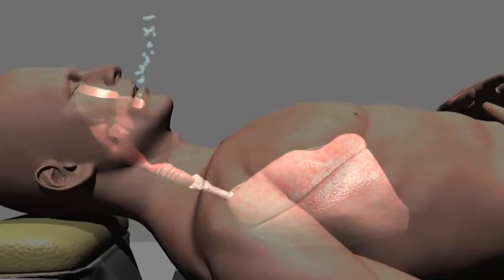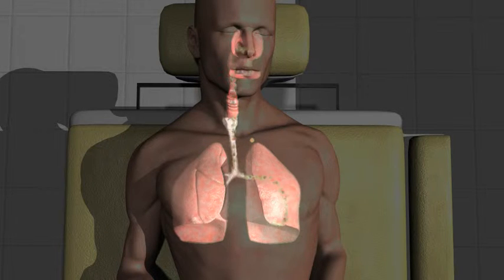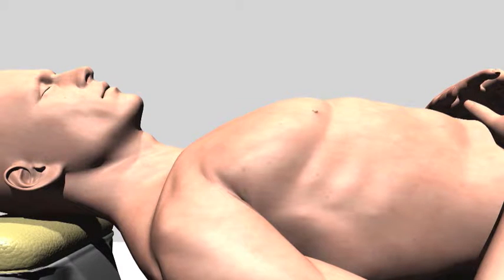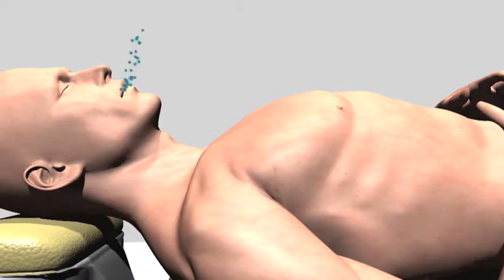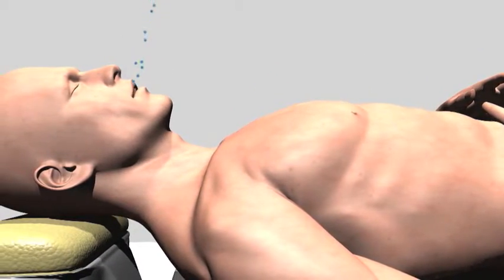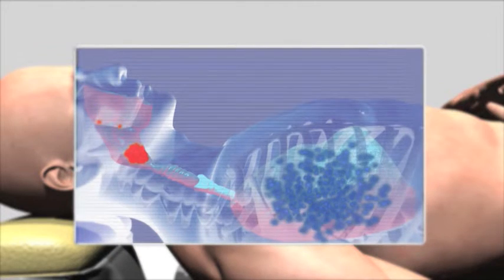Capnography monitors ventilation. It calculates respiratory rate through respiratory gas movement at the mouth or nose. Capnography provides an accurate respiratory rate while also monitoring adequacy of ventilation and airway patency with each breath. It also recognizes airway obstruction and apnea events.